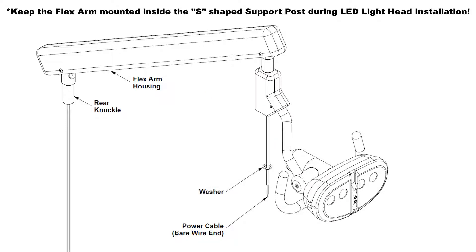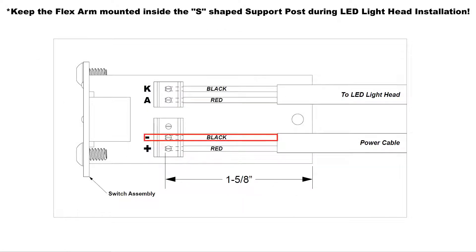Place the washer onto the LED wiring harness before connecting the bare wires to the switch assembly. Attach the black wire in the LED wiring harness to the switch assembly terminal marked with a negative or minus sign by sliding the bare wire into the terminal and turning the slotted screw clockwise until secure. Attach the red wire from the LED wiring harness to the switch assembly terminal marked with a positive or plus sign by sliding the bare wire into the terminal and turning the slotted screw clockwise until secure.